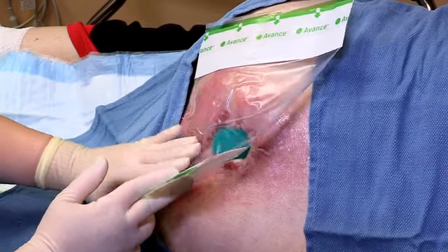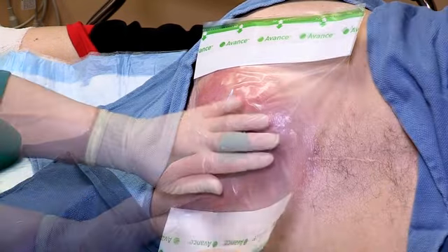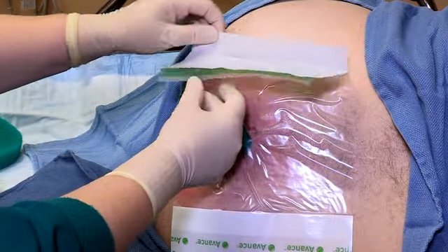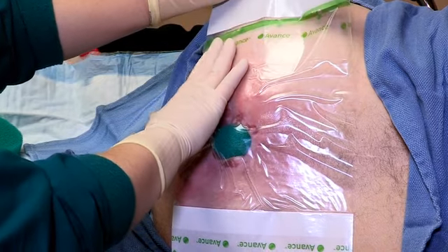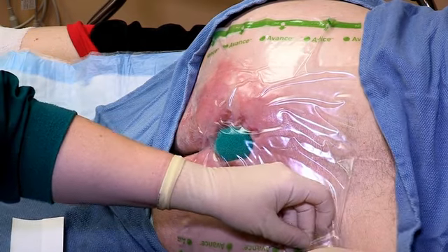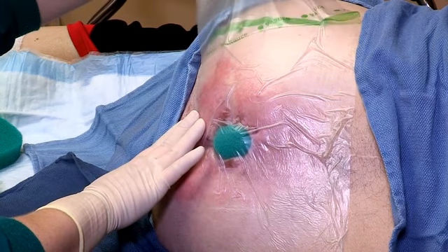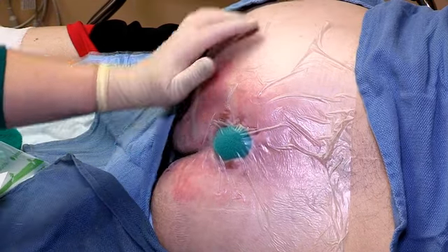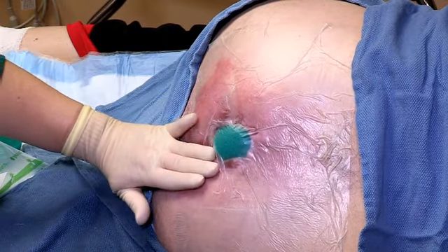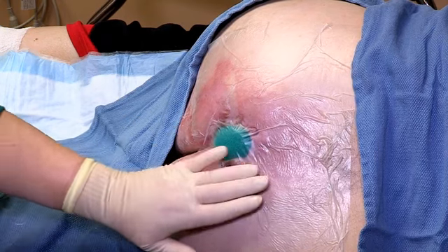Apply the film, without stretching, over the wound filler. Stretching the film during application may cause damage to the surrounding skin when negative pressure is applied. Next, remove the remaining end sections of the protective paper to create an airtight seal. Now, remove the transparent carrier or backing film using the green bar labeled number 2. Finally, press and smooth the transparent dressing down firmly around the entire wound for approximately 30 seconds to allow adhesive to seal and ensure a leak-proof wound environment.